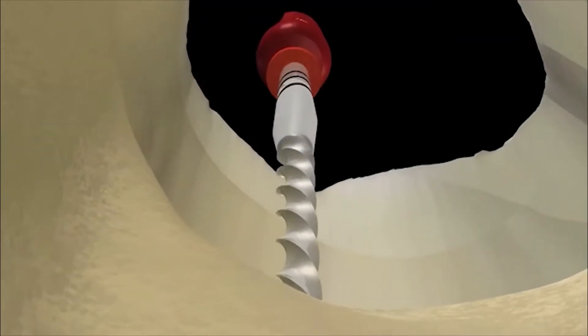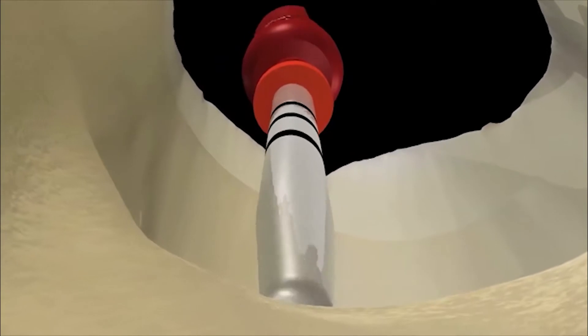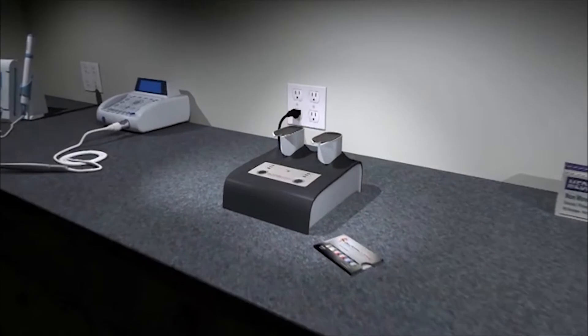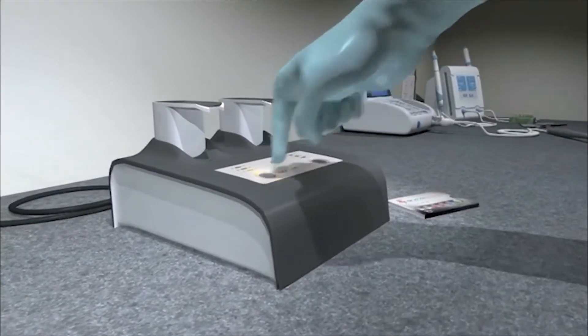Start by checking your final shape with a size verifier. It should fit passively at working length. After performing your final irrigation, turn the oven on by holding the size button until lit.